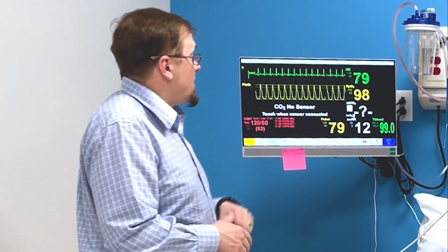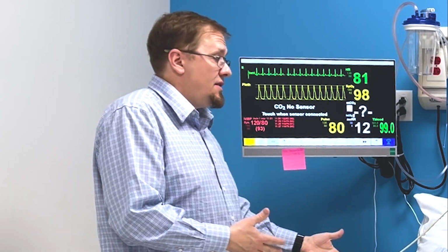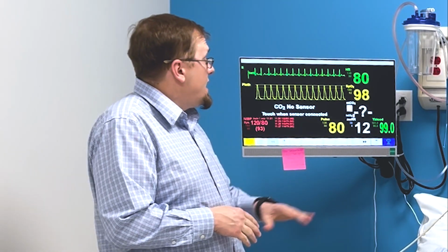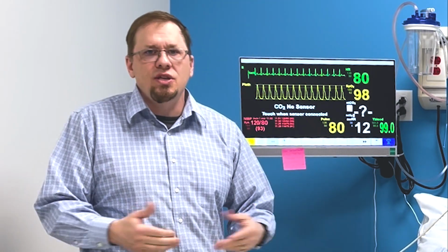From that point on, I usually go over to the patient monitor. A lot of our scenarios, we have a patient monitor because these are the indicators that they would be looking for to fully diagnose or give that full clinical presentation. So we like to have it on for a lot of our sims. So I talk about the ECG rhythm, and I have students of different learning levels, and they may know what it is and they may not know ECGs.